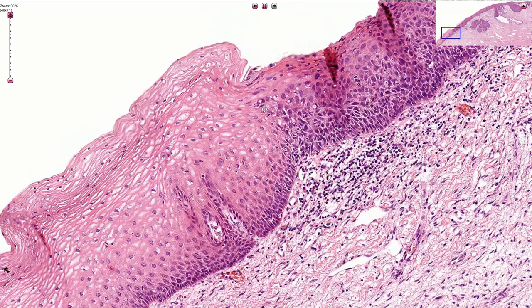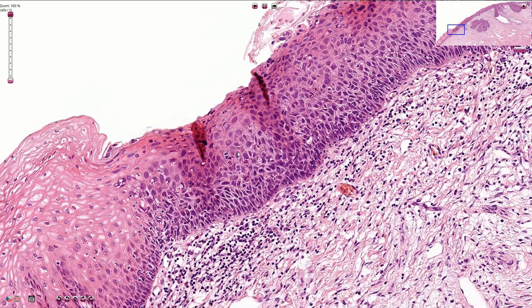On the other hand, in the dysplastic epithelium the maturation is disrupted — the cells do not mature. The cells with the bigger nuclei and small cytoplasm are seen not only in the basal layer but also in the upper portions of the epithelium. Nuclei are irregular and hyperchromatic, and we can see multiple mitotic figures here.